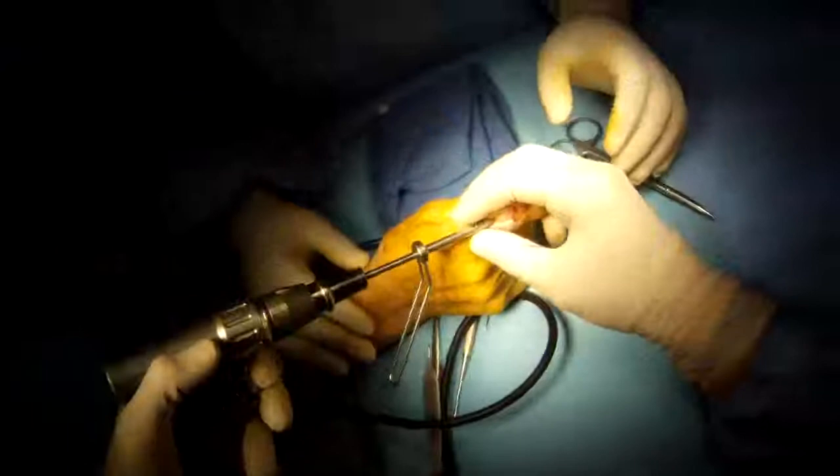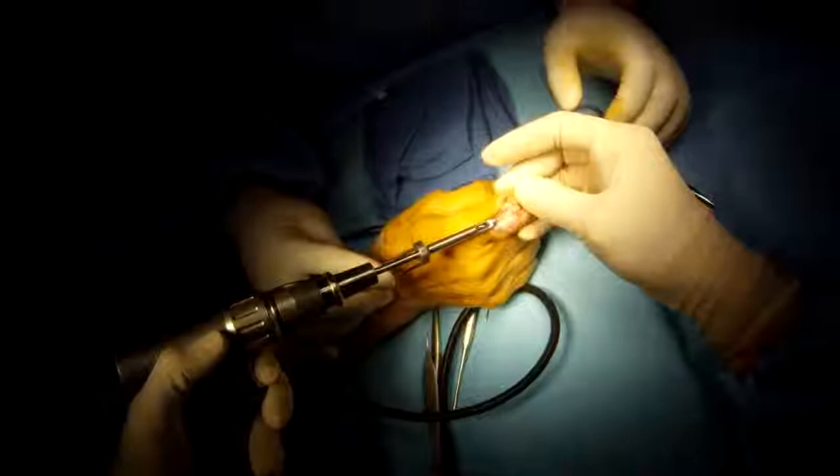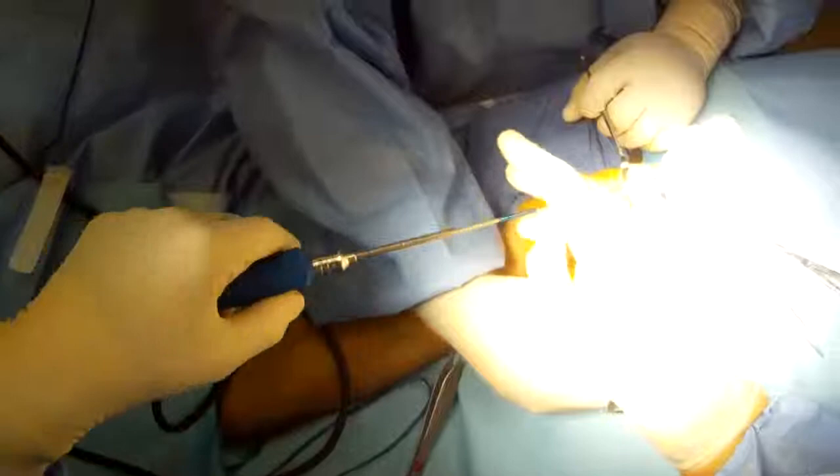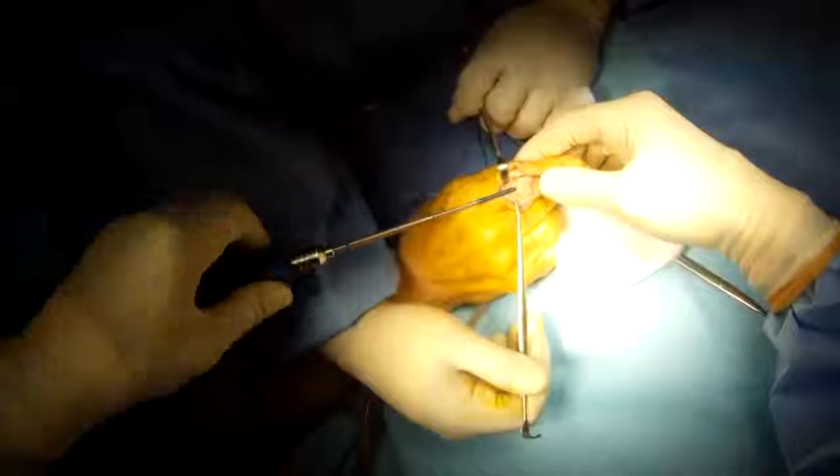Use a cannulated drill to over-drill the wire, and place the cannulated screw to provide strong, stable fixation in the desired position of fusion. This allows for early motion of the rest of the finger.